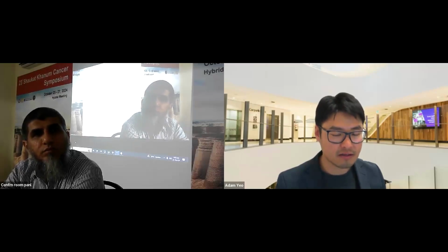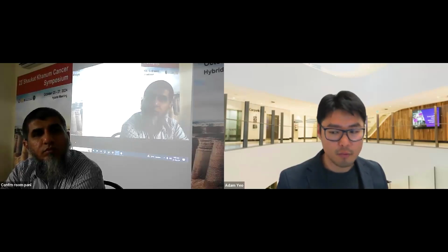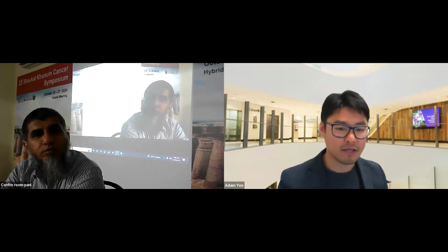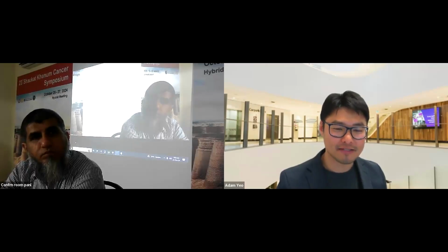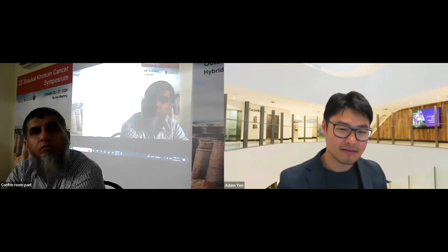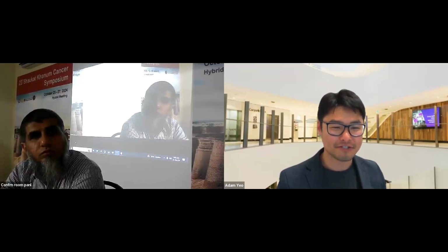We did see quite significant intrafraction motion. But when I say significant, it's all related to the PTV margin. If you have a 1 millimeter margin, half a millimeter off is significant. If you have a 1 centimeter margin, even 1 millimeter is not significant at all. So it's all relative to the PTV margin you put on. I'm aware that even half of the SRS world goes with a no-margin recipe like Gamma Knife. In that case, with anything more than half a millimeter off, you can miss out on 30% of coverage.